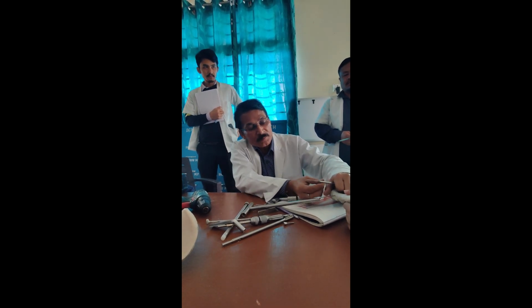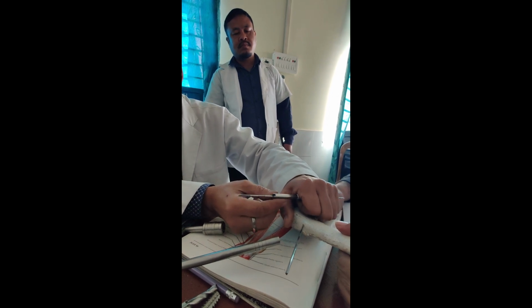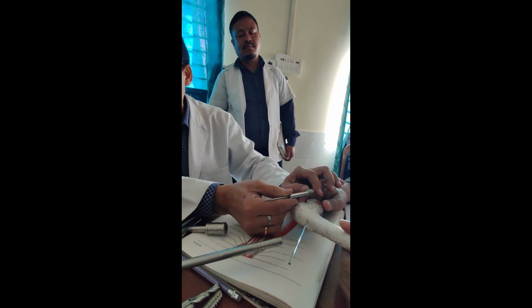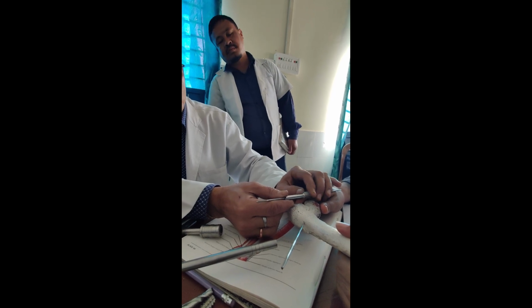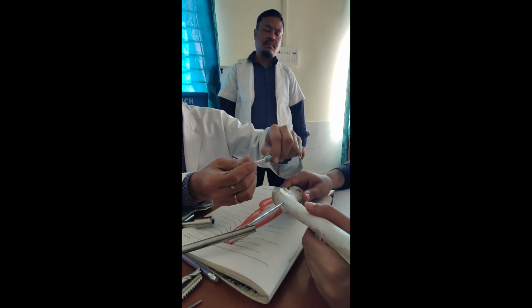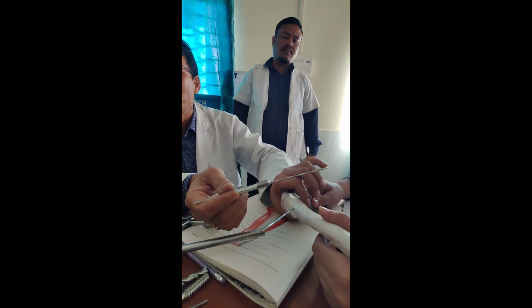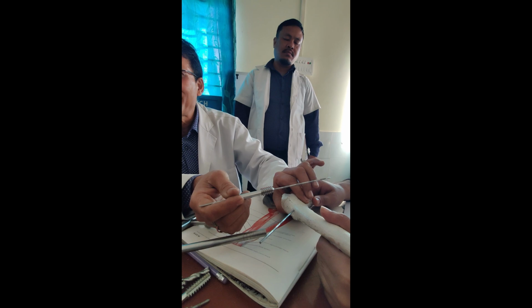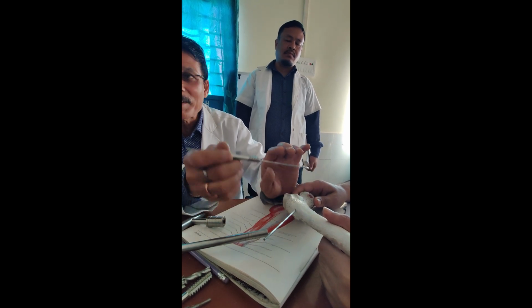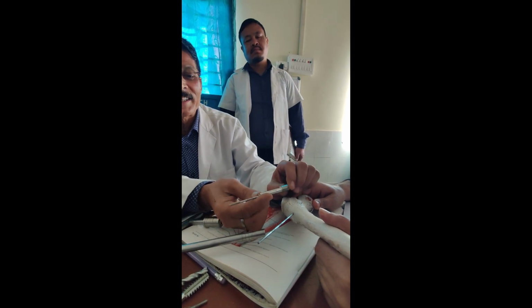The final part is very important, because if your angle plate is like this, then while you are inserting the plate, it will be like this. So in the final area, while it is stuck strongly and you try to do the rotation, the whole fragment may move instead of the screw going inside. That is why sometimes the K-wire is very important to fix it, or you can hold the bone with the bone holding. Otherwise, if it is very difficult, it is better to reverse it one thread, so as to make the thing like this.